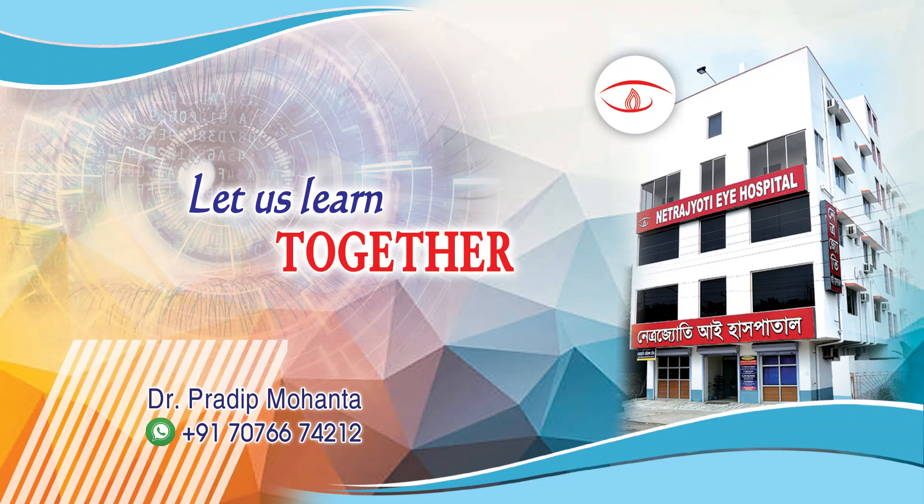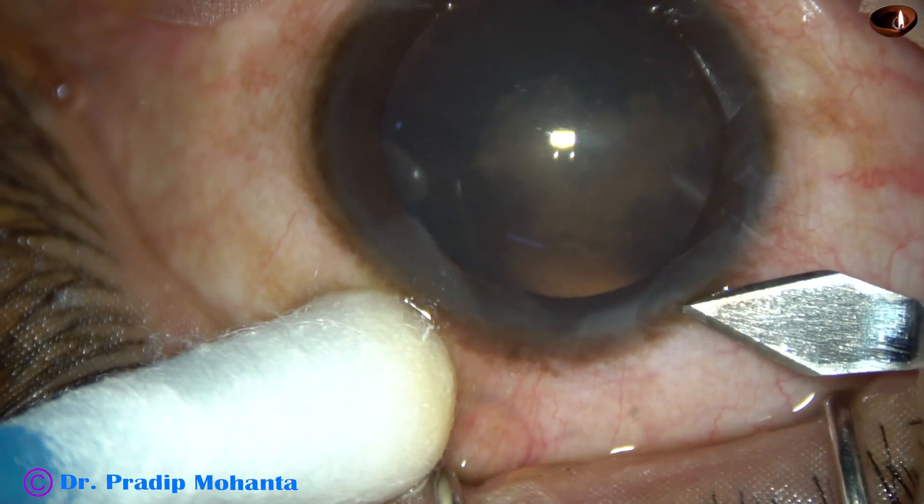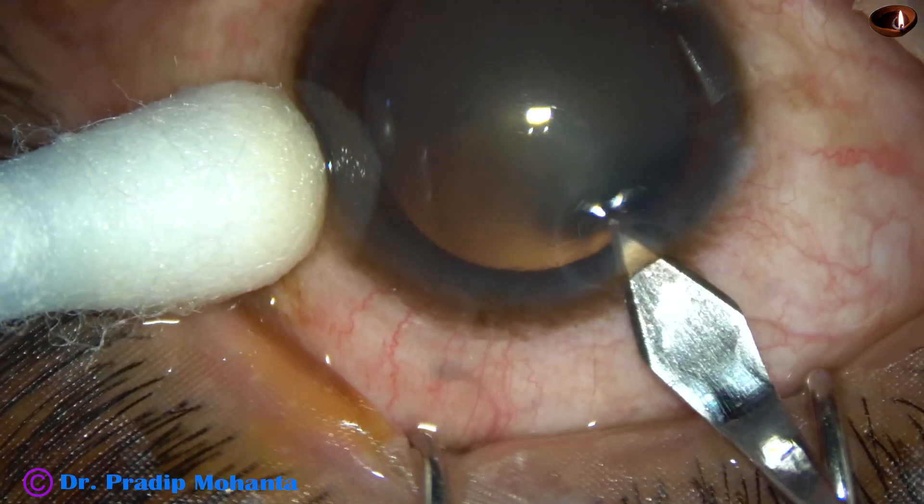Friends, welcome to my workplace at Rana Ghat, West Bengal, India. This is a posterior subcapsular cataract with very soft nucleus. Let us observe this surgery.